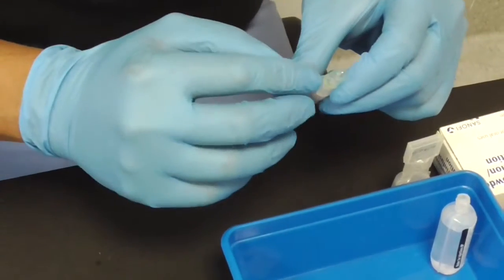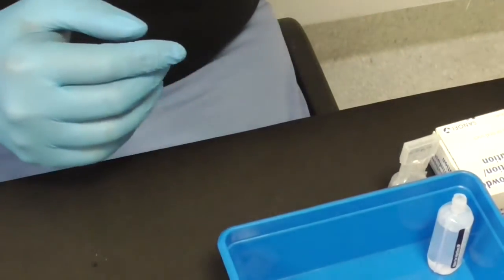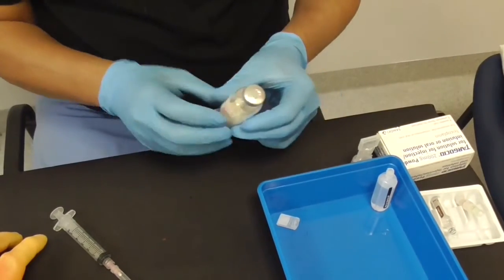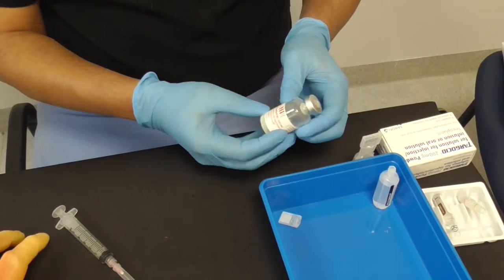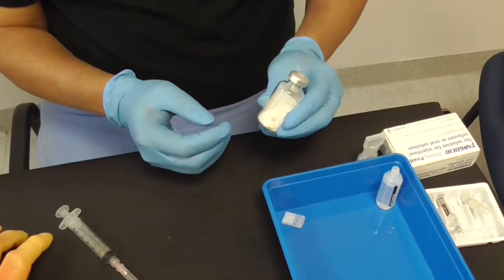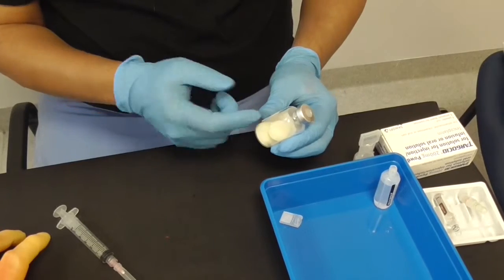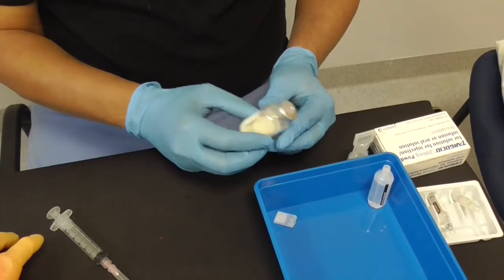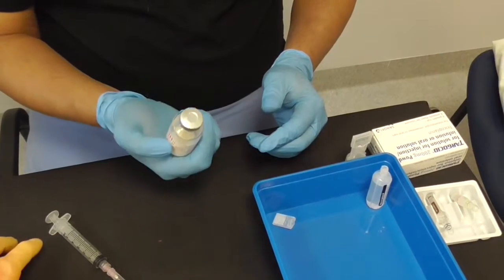And again, this has a snap off the top like the one that I showed you previously. The third type is that you've got a bit of solid, like this is a bit of Targocid, which is an antibiotic. That comes just as a powder form. That powder form, you've got to add a bit of liquid inside it to actually get it to dissolve before you can administer it.